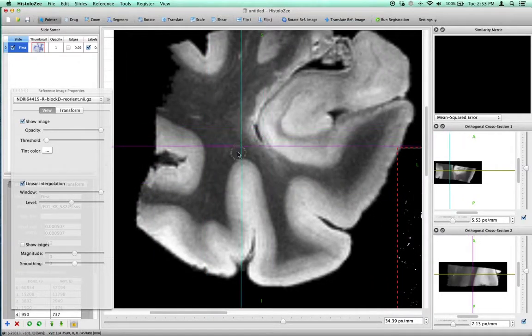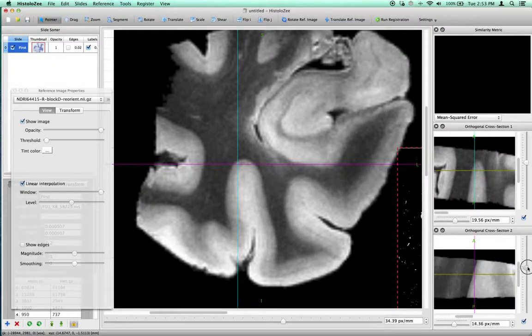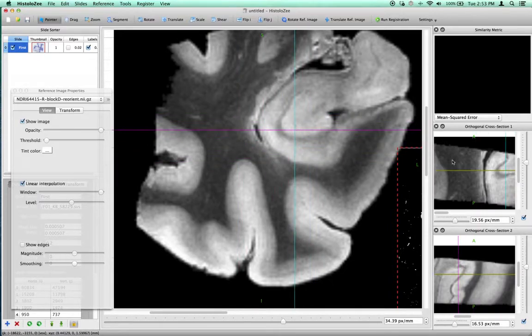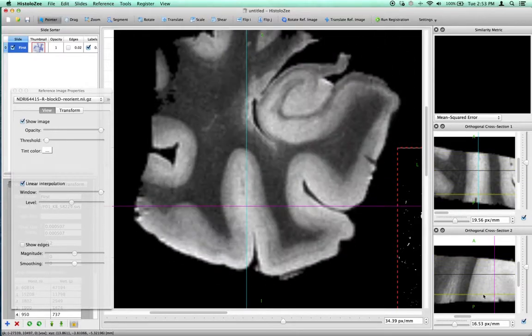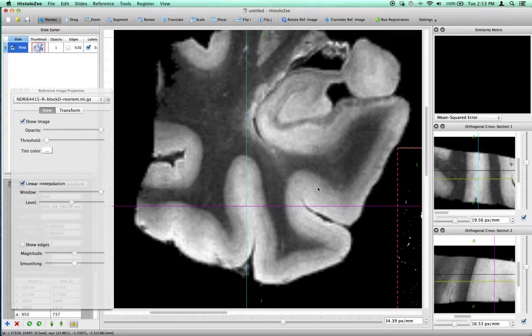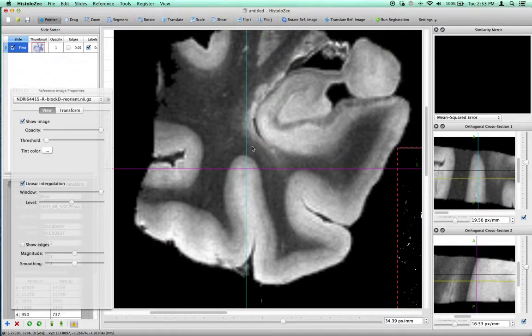We can move the cursor coordinates just like in Snap and see things updated in our 3 views. We can even move into and out of the view plane using the right mouse key. We can do the same thing in the slice plane using shift and dragging.